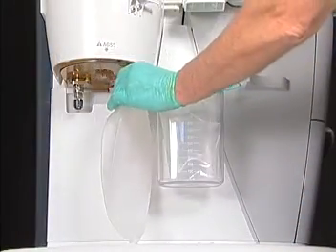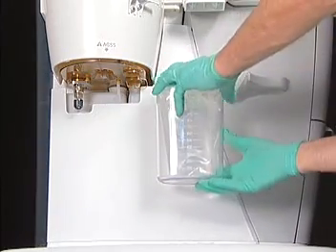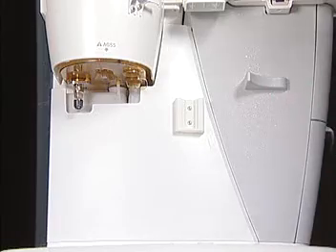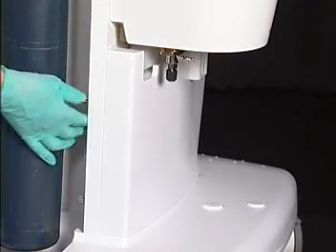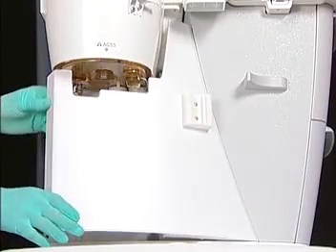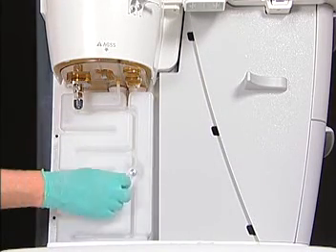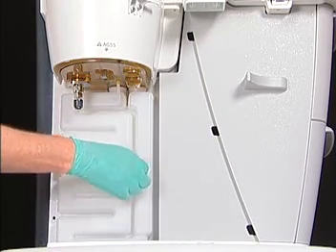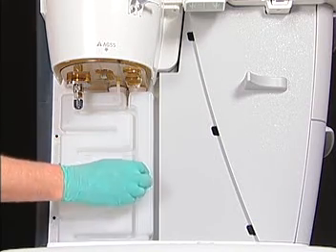The AGSS receiver may also be removed for cleaning and sterilization after the ABS has been removed from the Aspire. On the back of the system, to release the system's side panel from the Aspire, loosen the two thumb screws on the side panel. Slide the side panel out by removing its tabs from their slots. Next, loosen the thumb screw on the side of the reservoir and remove the reservoir.